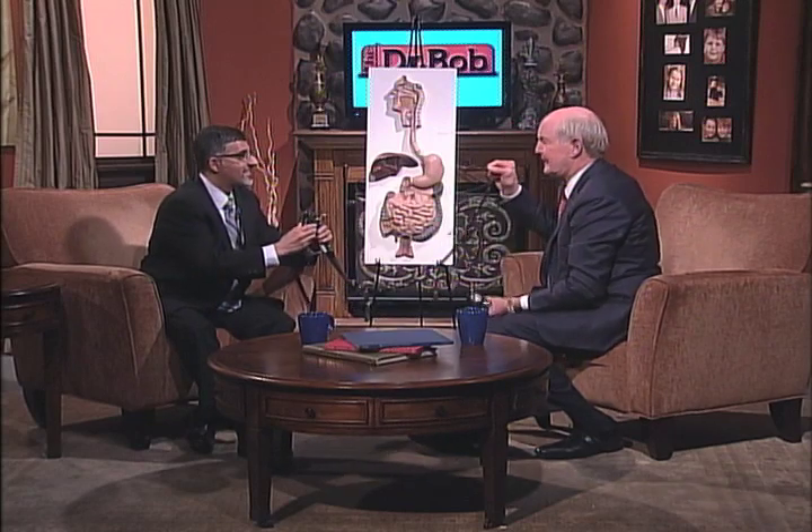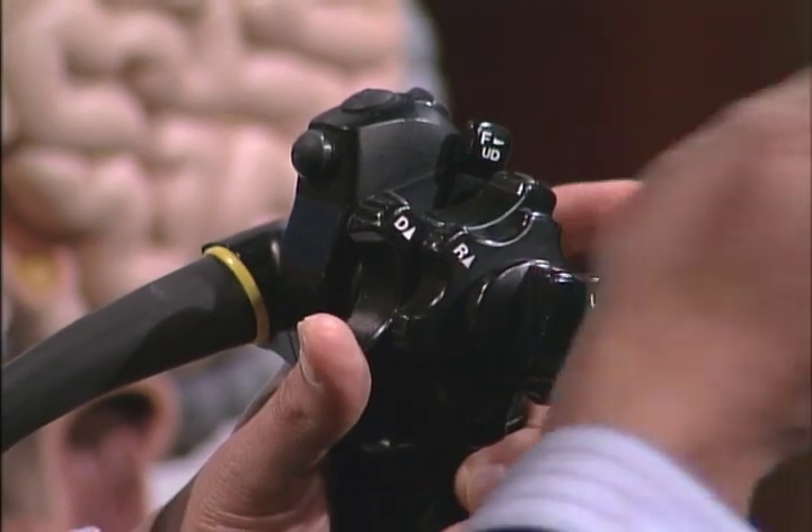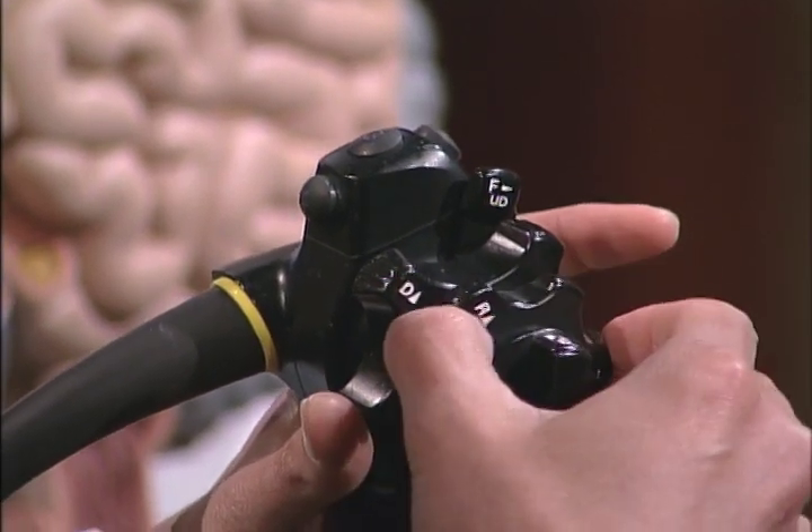What have you got in your left hand? This is the steering wheel, if you want to call it that. I've got the power source and the camera, so you've got the steering wheel there. That's right. If the end of the endoscope is flexible, as it is in modern day technology, then this allows us to steer it in different directions — we can go up, down, left, or right using this device right here.